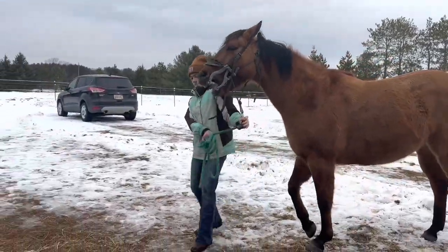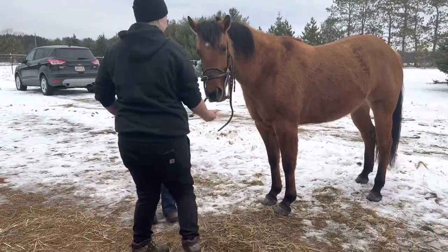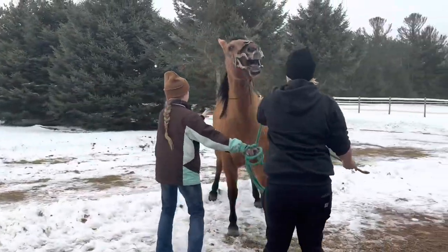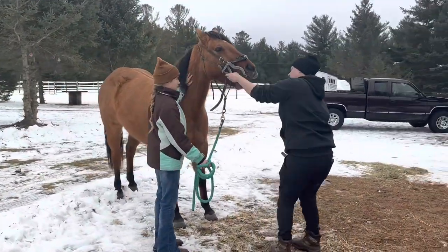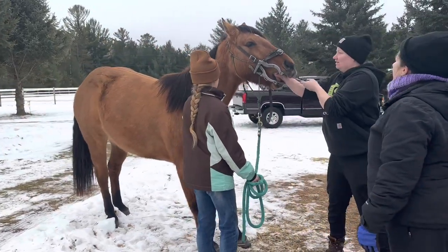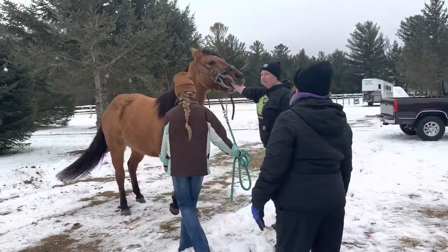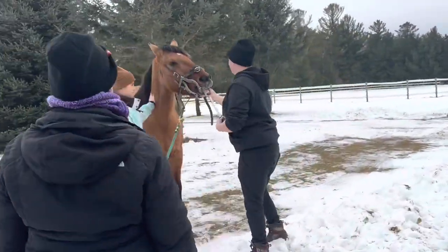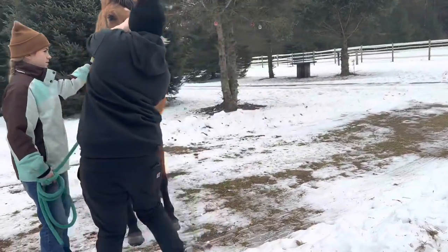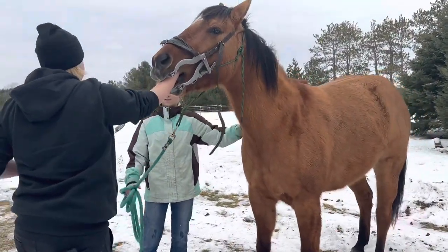So now, this is what they call an 11 tool, and so you can get the furthest back teeth. If she wants to go backwards, I'm not gonna protest, because backwards is a lot better than forwards. You gotta remember, this is so invasive. She's only 5 years old. From the judging, from the size of these points, she's never been done.